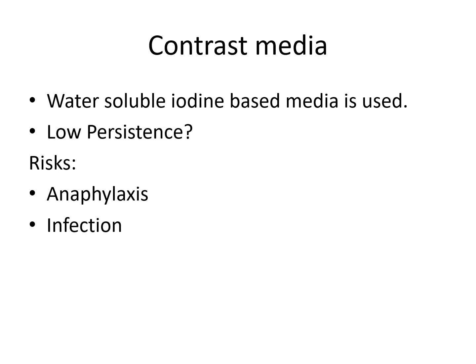Risks are still anaphylaxis and infection. You should be utilizing sterile technique when injecting contrast into the biliary system through any of the procedures, and the patient should be screened with history and physical pre-procedure to ensure that they are not allergic to iodine contrast, because the contrast will end up in their small bowel and they will absorb it into the circulatory system post-procedure.